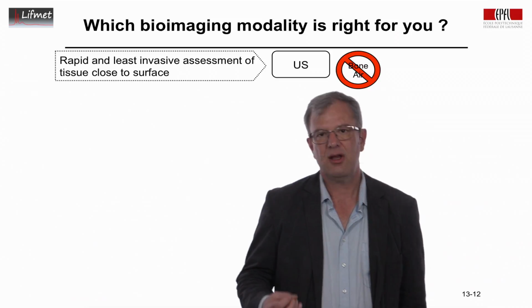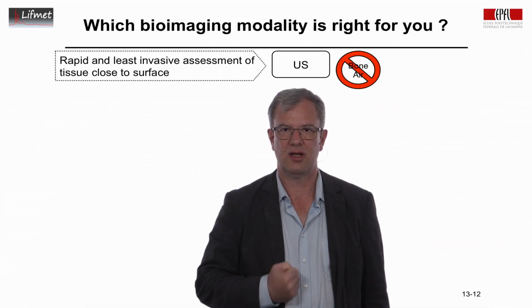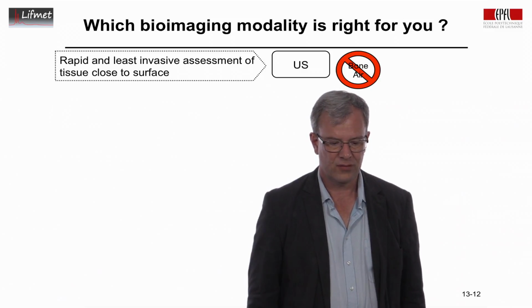I mentioned the air here because this is one of the major reasons why one uses the ultrasound gel on the transducer put on the skin, so that there are no air pockets in there that produce these artifacts.